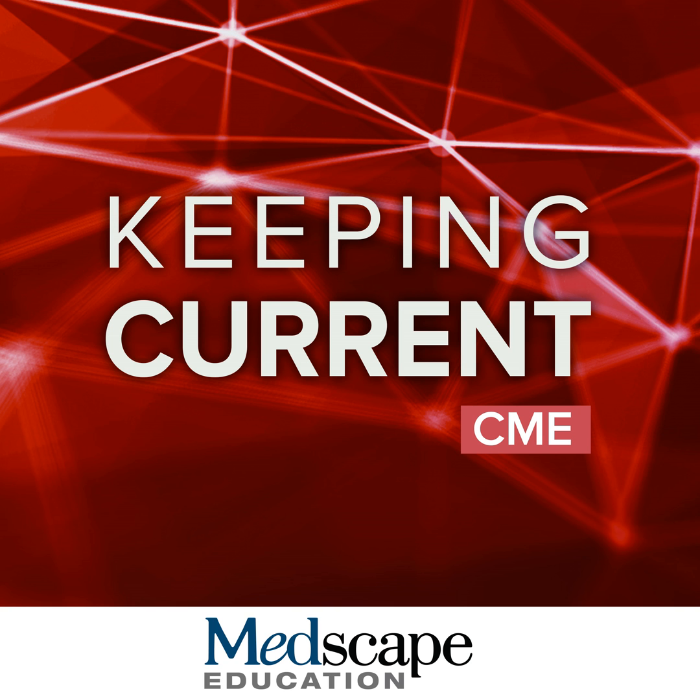And we know that this is an adverse prognostic indicator. So patients who have an acute MI and microvascular obstruction tend to have a worse prognosis. And so it's really important that we comment on this. And we do need to distinguish this from thrombus, which is more common, and thrombus would be layering within the blood pool, not within the myocardium.